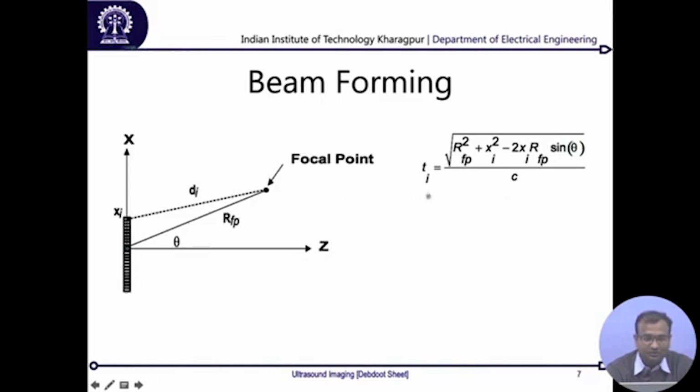Now look into one particular point: the distance from the transducer of this particular point is a constant factor that does not change with the elements of the transducer. The inter-element spacing between the transducers is also constant. That is why you actually know what is the distance between the center point and every single ith transducer, which is also constant.